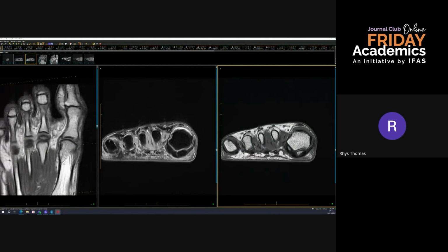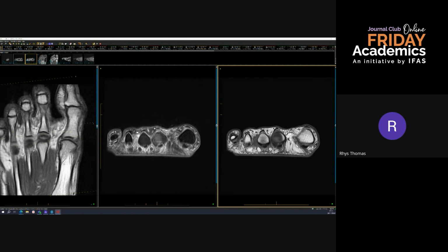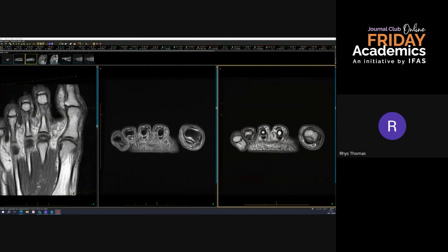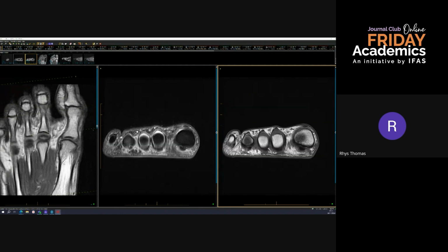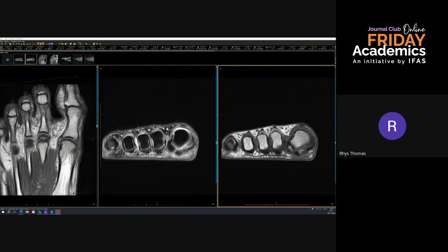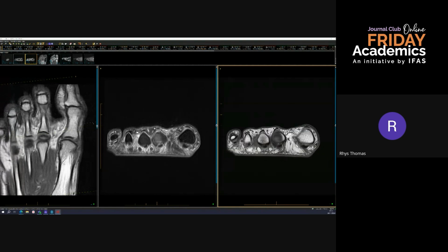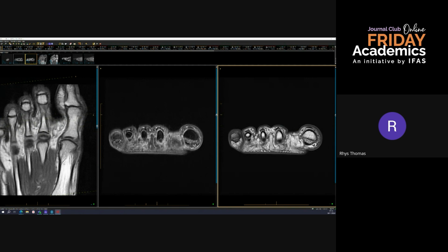The neurovascular bundle is going to be here, and I suspect that is the nerve just below my mouse, and you can see it starting to separate and go up into each toe. That's the digital nerve. Now, in the next one across, this is the digital nerve here, and we've just got this focal thickening in the intermetatarsal space, and then that continues as the interdigital nerve.